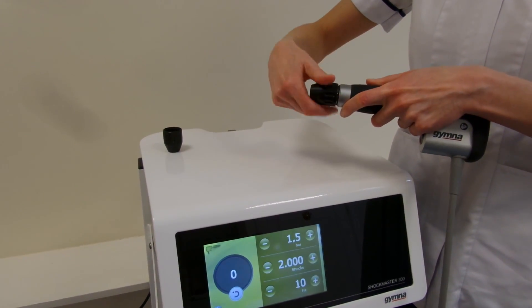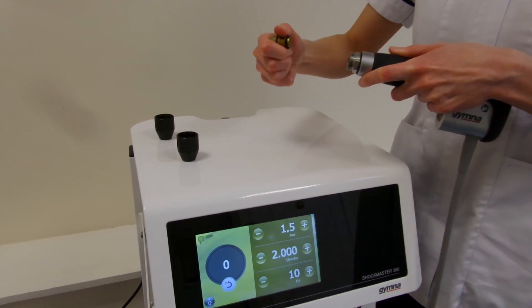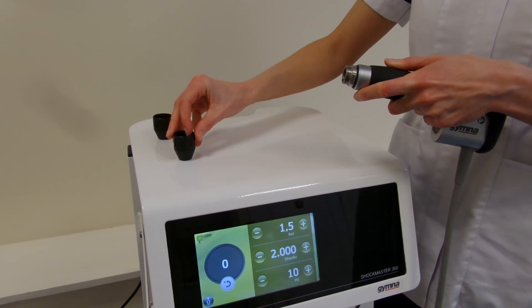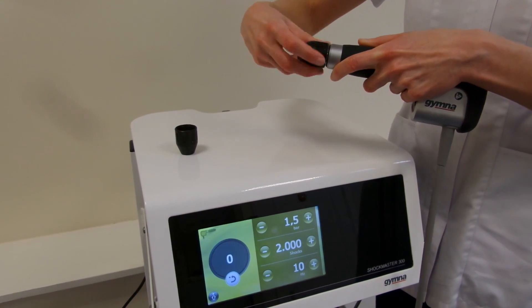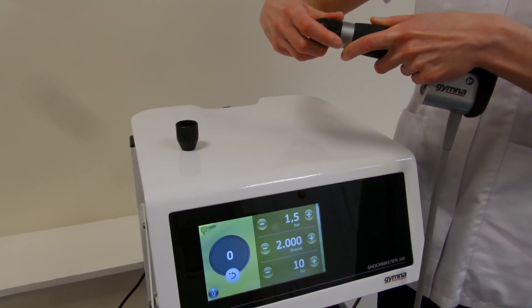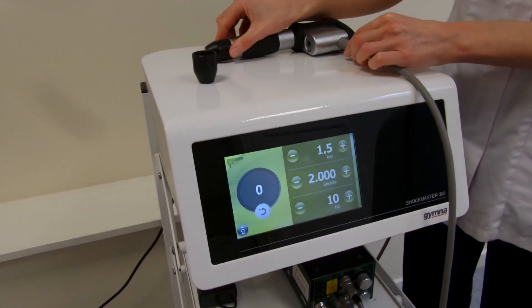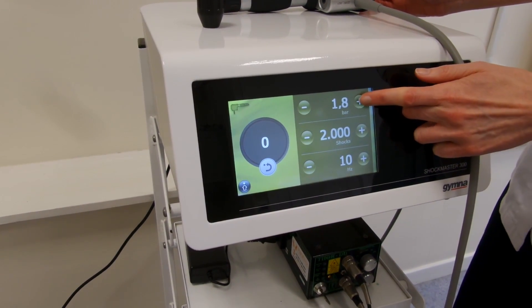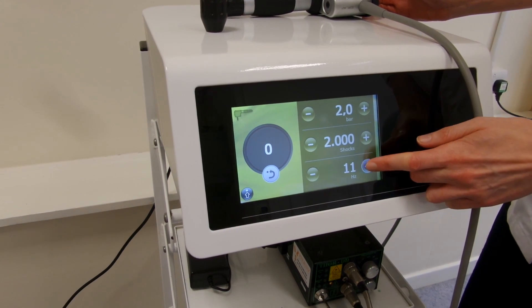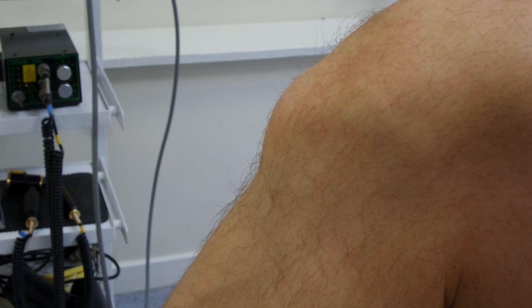To begin this treatment for Osgood Schlatter's, the therapist is first going to remove the 15mm heads from this Shockmaster 300 from Gymna and apply a 15mm convex head. You can tell this is a convex head as it's silver and not copper in colour. The settings are brought up to 2 bar and 12 hertz for 2000 shocks.